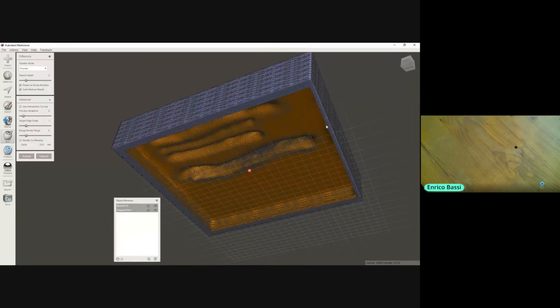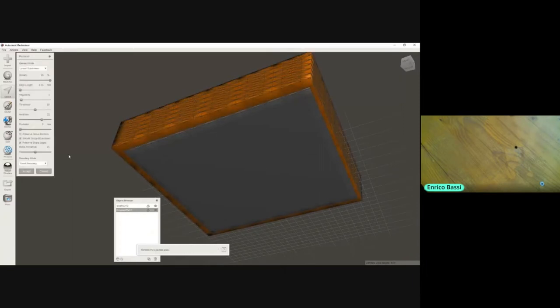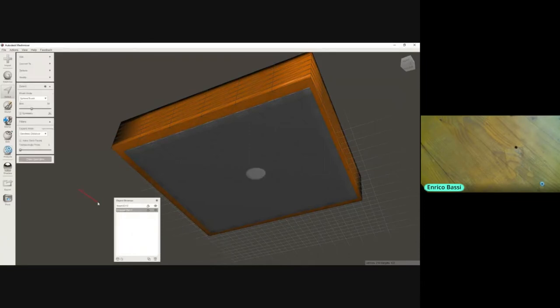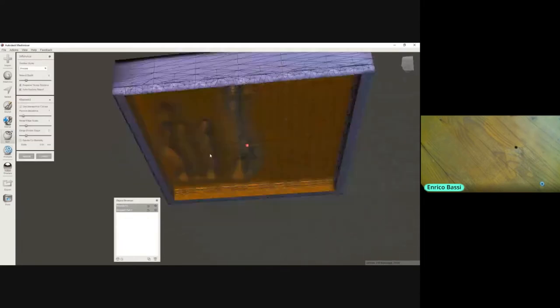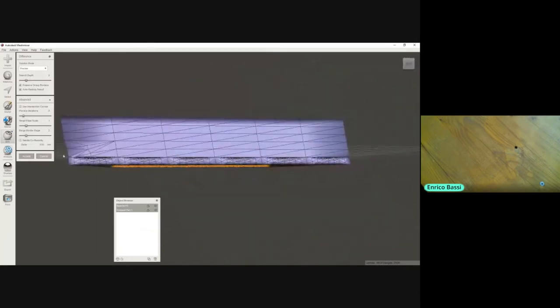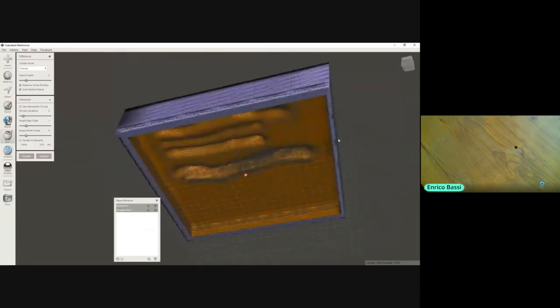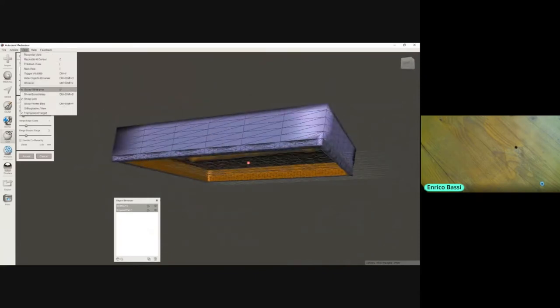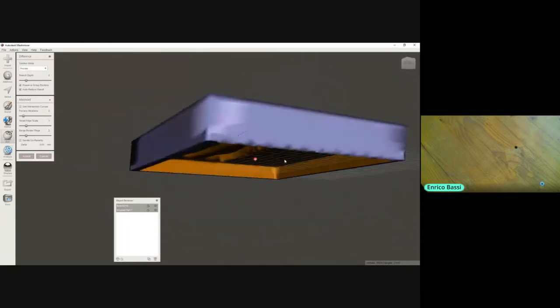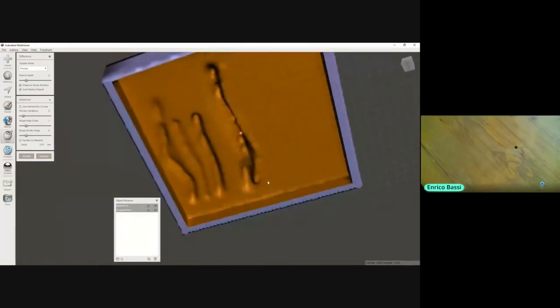But we can see if it might be able to actually do that without me remeshing. Okay, this was the original resolution. Okay, so this and that. In this case, it actually did a decent job besides the corner. Being on the outside, I don't care. But you see that here you have some defects in how it remeshed the edge. If I show it to you without the wireframe, it's more clear. It's strange. Okay, yeah, it creates some artifacts, some unnatural things.